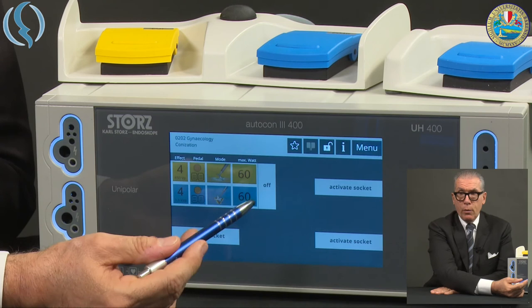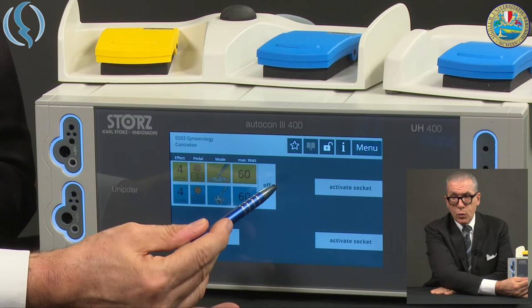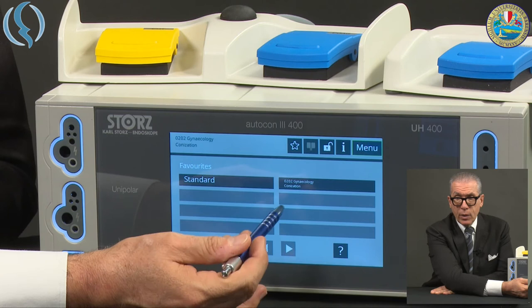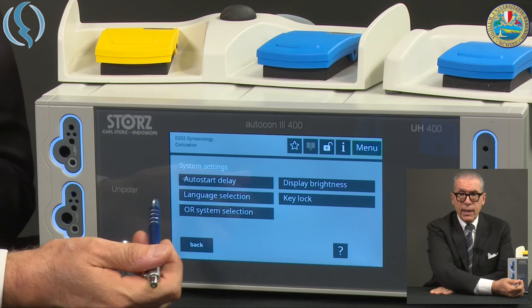Once we have decided, we confirm and go back to the main menu. If a notification appears that you don't want shown on screen, just click off and it will disappear. Back to the menu: Favorites shows you the same as the star — your favorite programs. There are the standard ones and, for example, gynecological conization. The next option is System Settings.